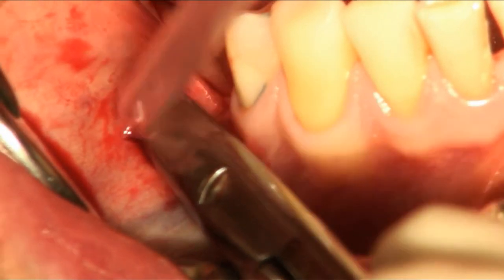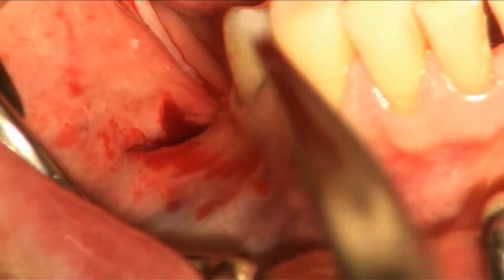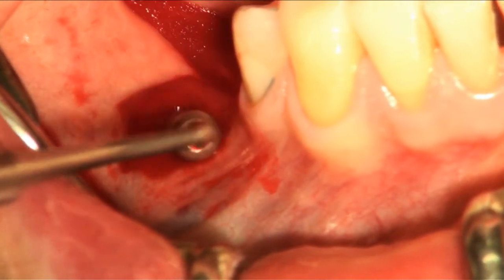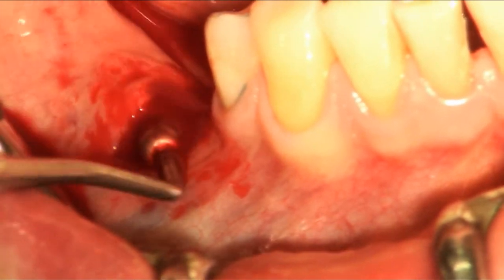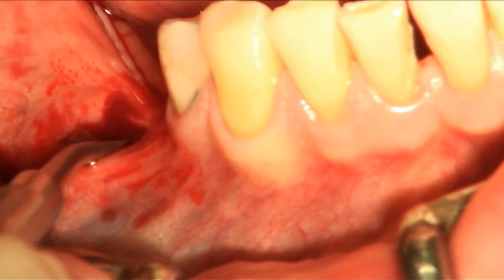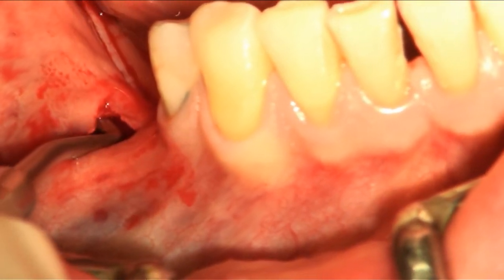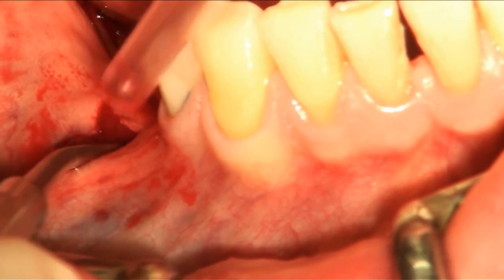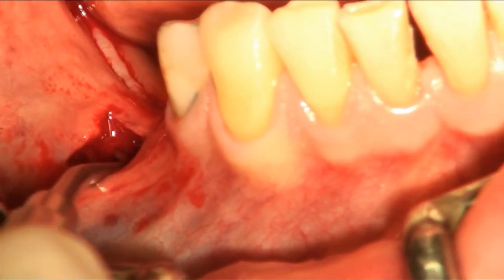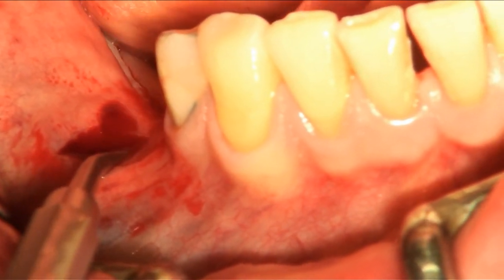Now we have a fine and elastic pouch above the periosteum. And as soon as the template fits into the pouch, our preparation is finished.